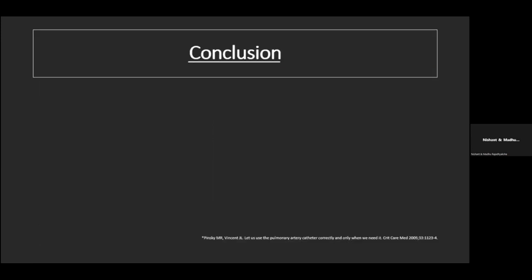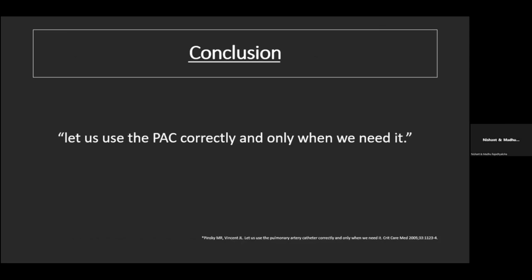Even though the use of pulmonary artery catheter cannot be recommended as a matter of routine, a definite role is suggested in selected group of patients undergoing cardiac surgery. As stated by Pinsky and Vincent, let us use the pulmonary artery catheter correctly and only when we need it. Thank you.